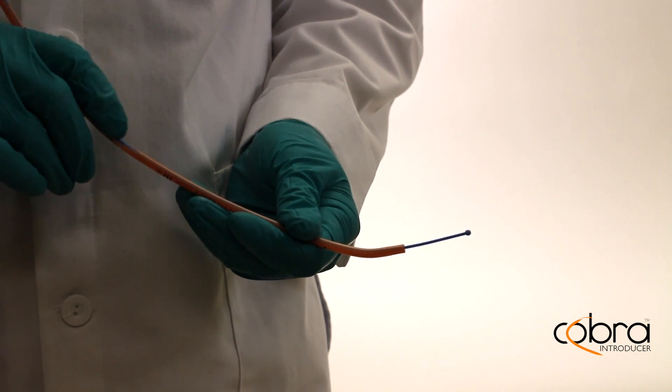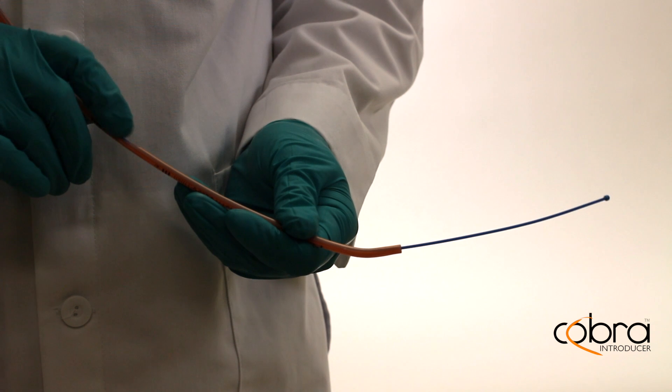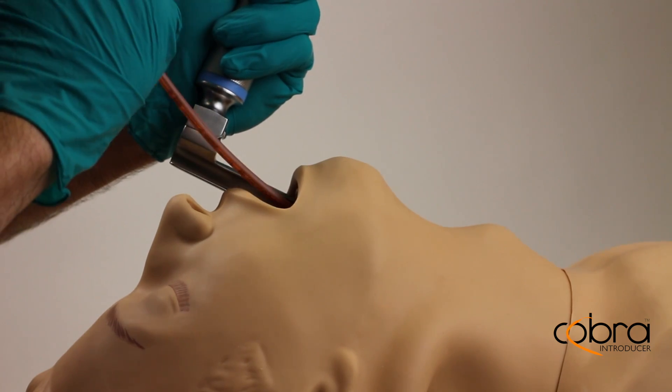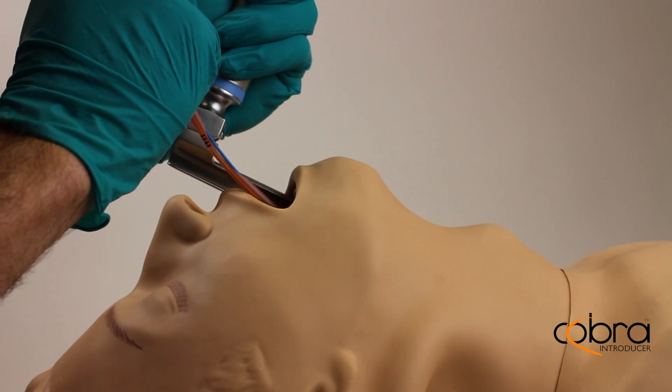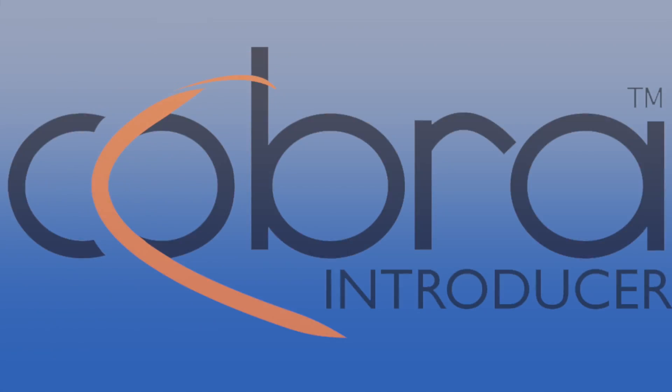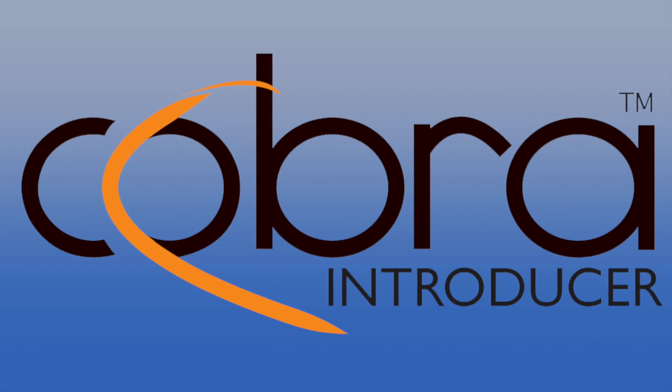When intubating patients, time is of the essence. The Cobra Introducer is critical for ensuring the effective intubation of difficult airways and ultimately giving us better tools to facilitate better outcomes. The Cobra Introducer is airway management reimagined.